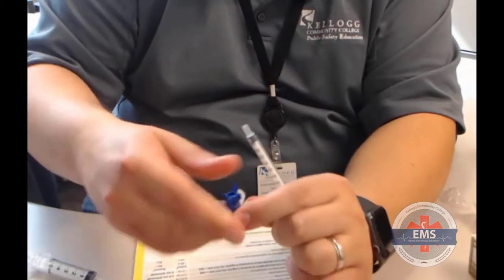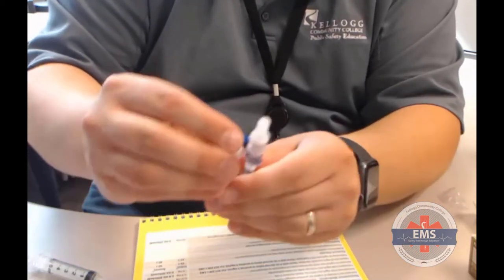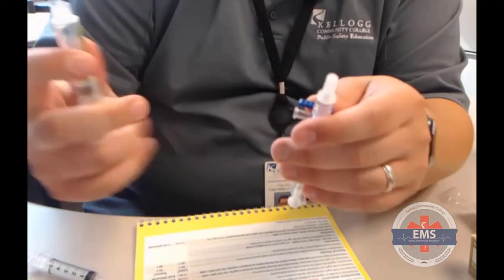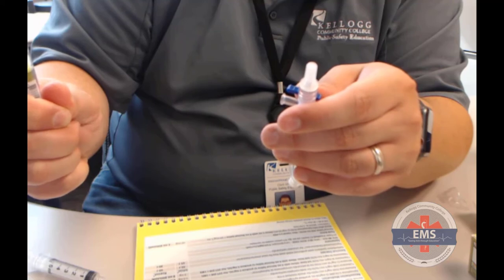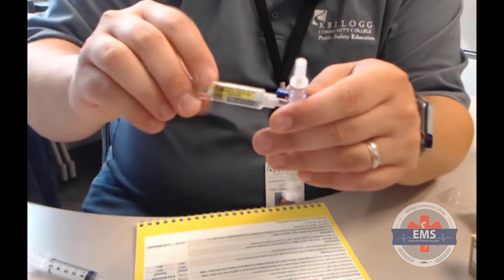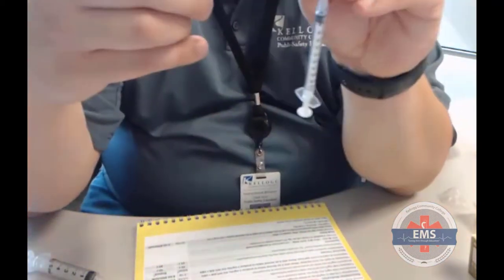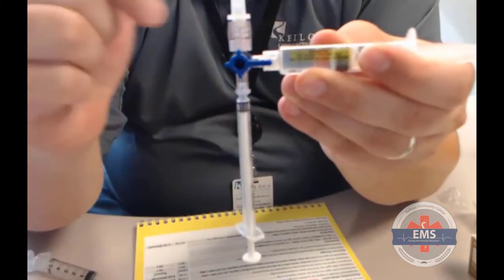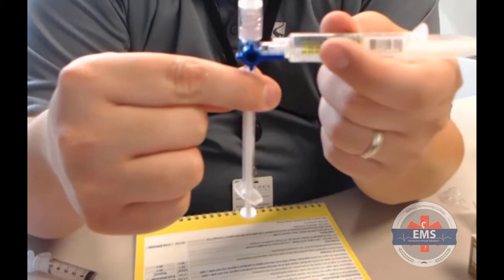I'm going to take the caps off my stopcock, only 2 of them. Remove my cap. I've got a little bit of air in here, guys. Get the air out of the pre-filled syringe, and then I'm going to hook that up here like so. Now I can easily take my stopcock and put it the right direction. I'm going to turn this; wherever the arrow is pointing to is off. So right now this port is off.